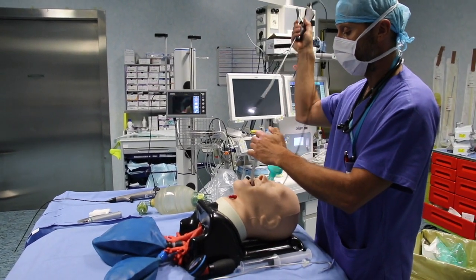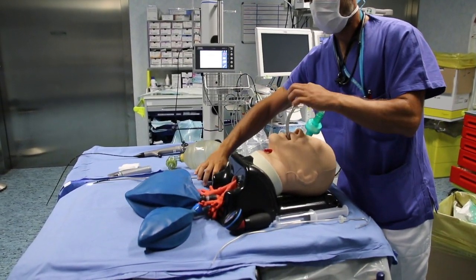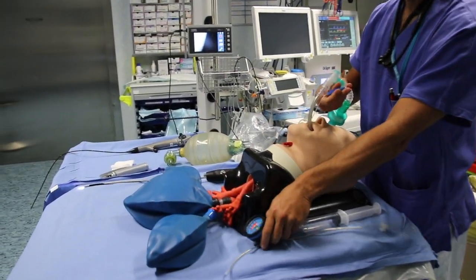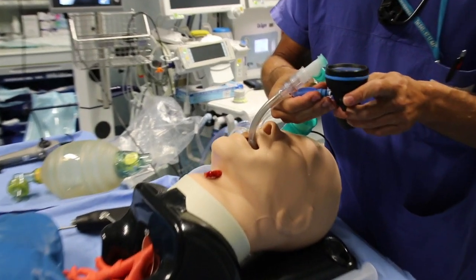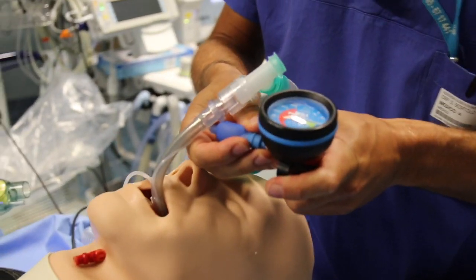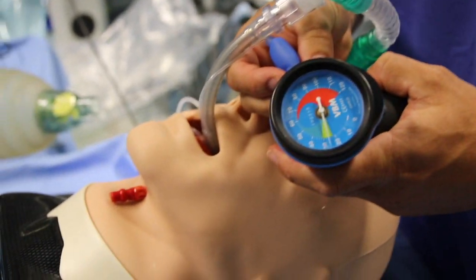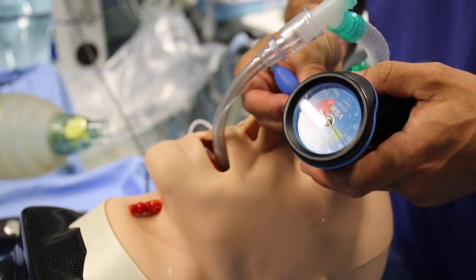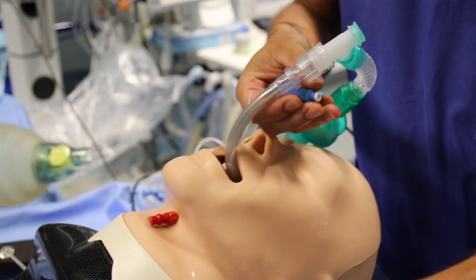Now you can remove the video stylet and proceed with reinflating the proximal cuff, which is now sitting in the trachea, with the help of a pressure gauge. In this way, we check that the cuff is not leaking and no damage has been done to the patient's tissues.